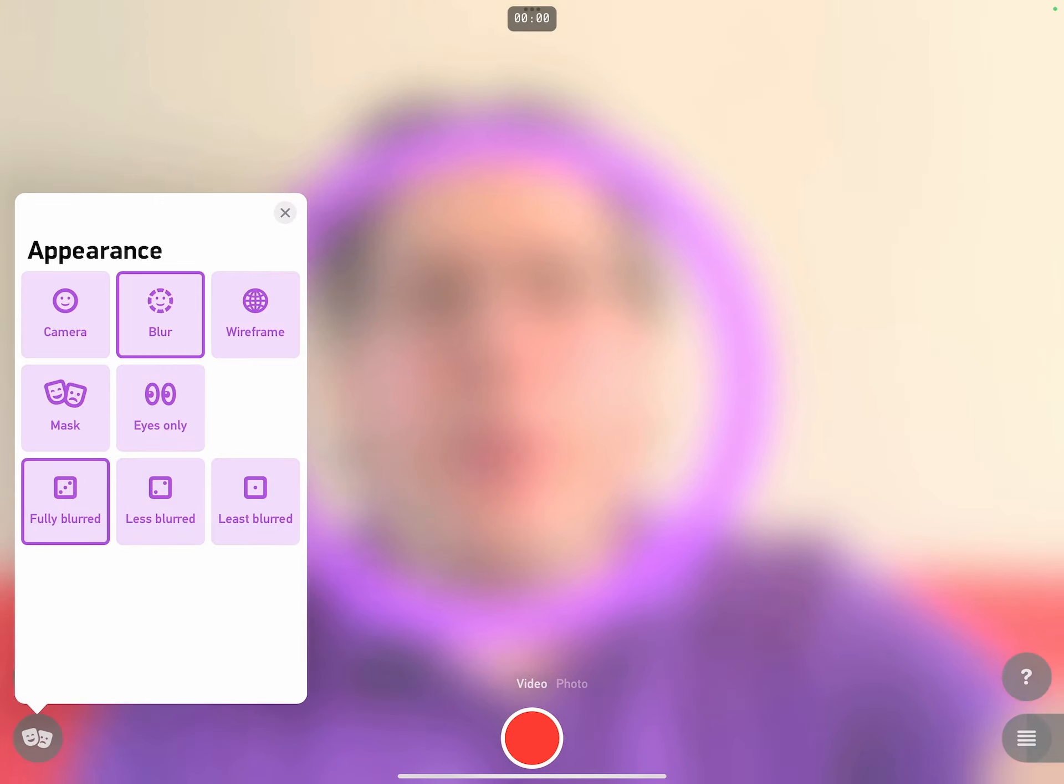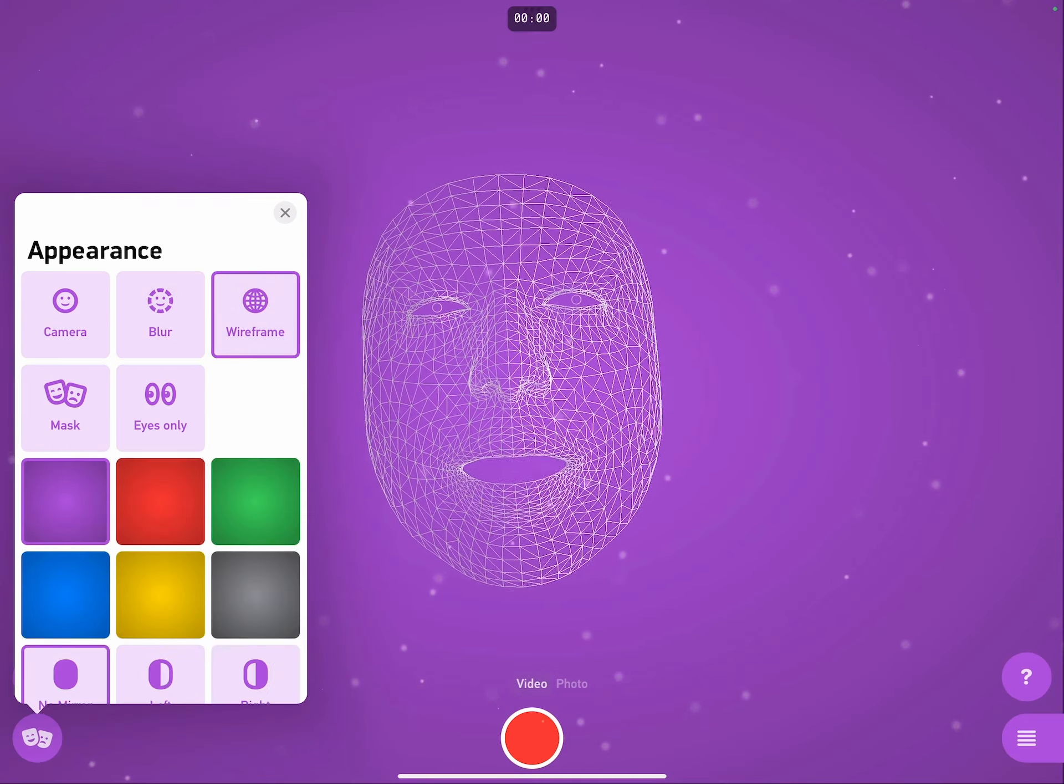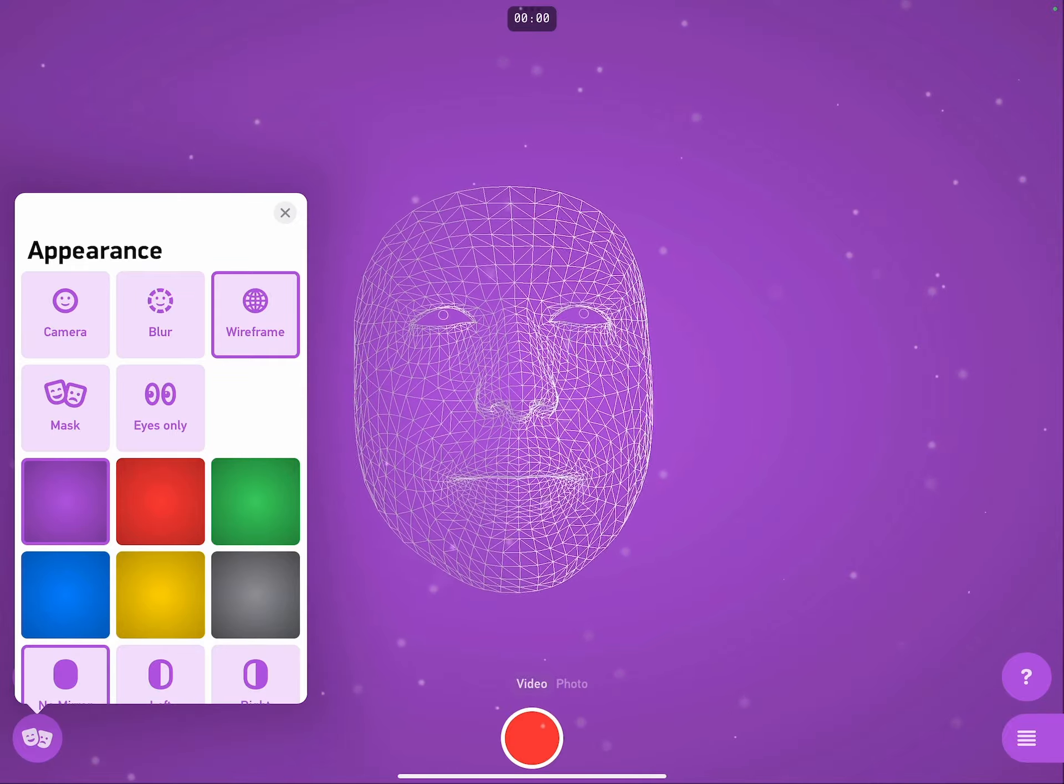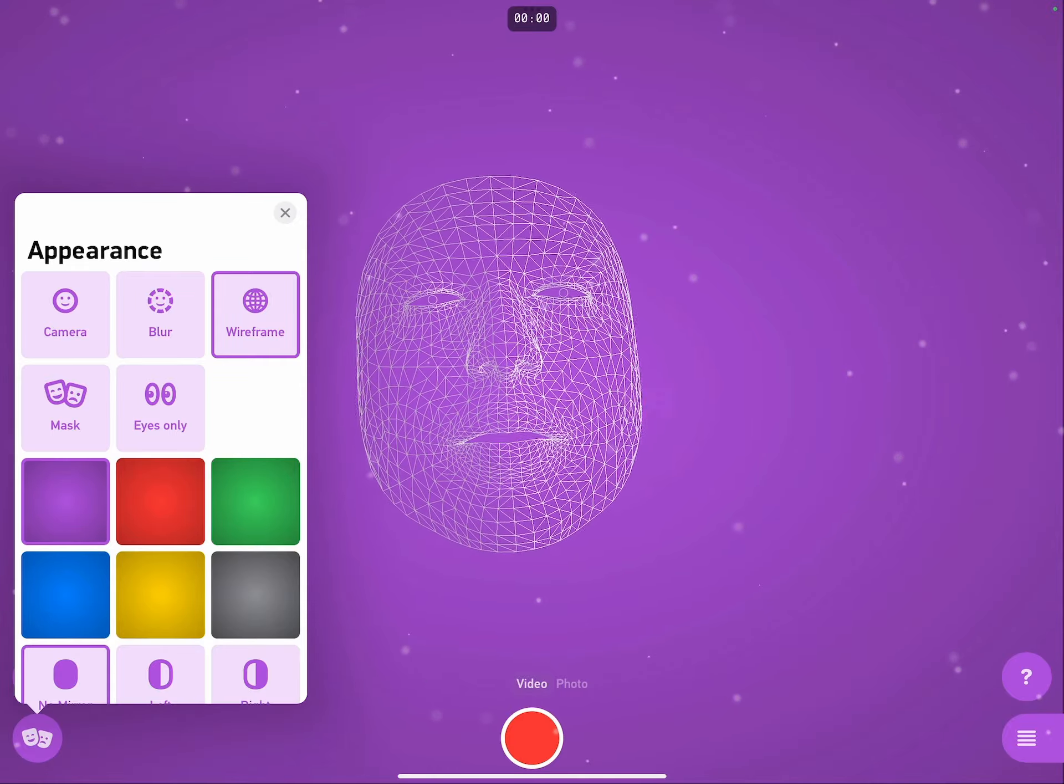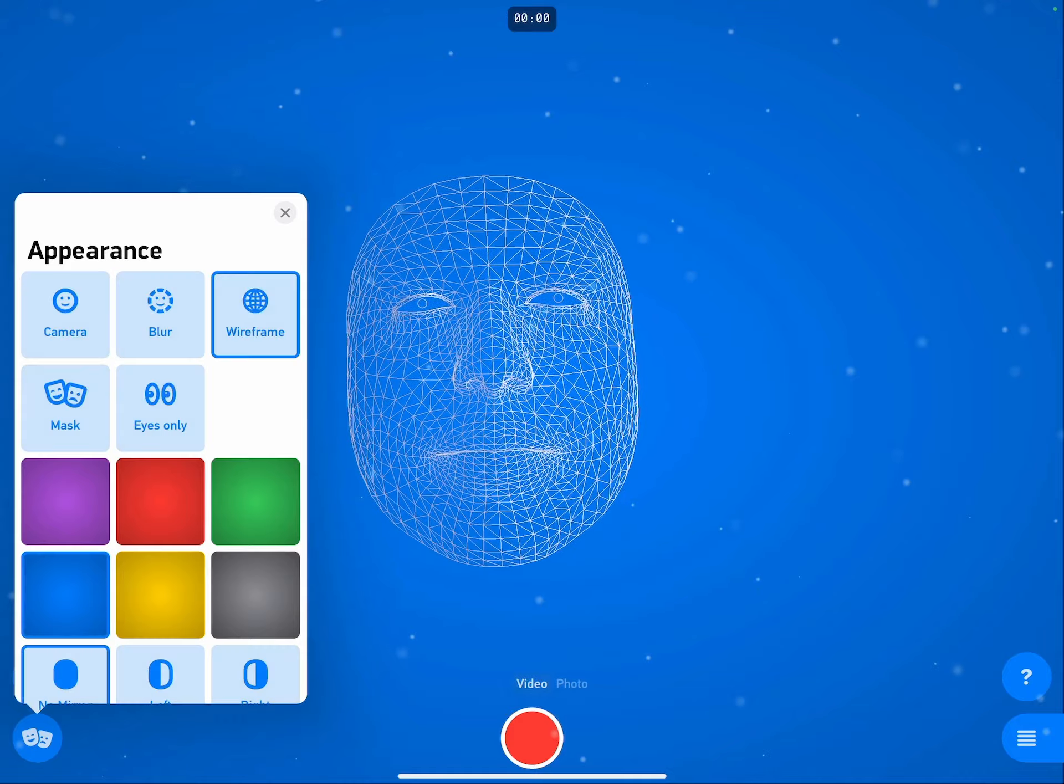But if I need a bit more definition than that, I can tap on wireframe and see a completely virtual reality mask. I can even choose what colour background I want.